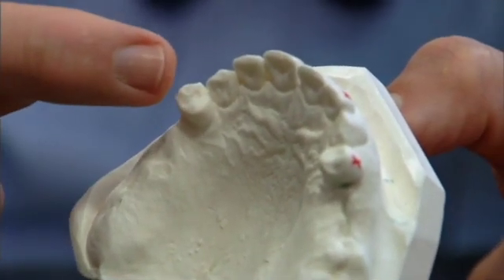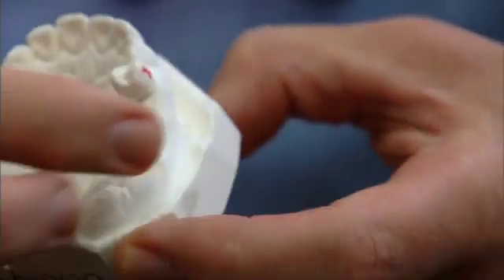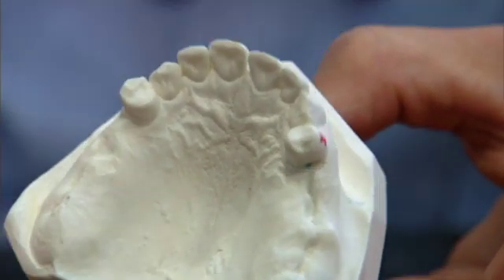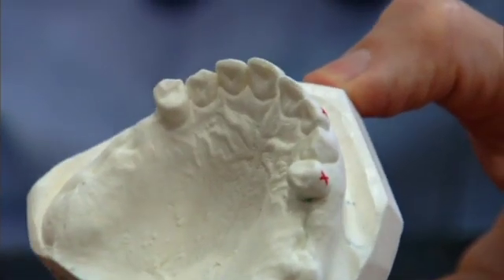that will get its retention and a certain amount of lateral stabilization from 2 implants in the site of 5 and 12. We'll use Nobel Biocare 4.3 implants diameter by 13 millimeters.